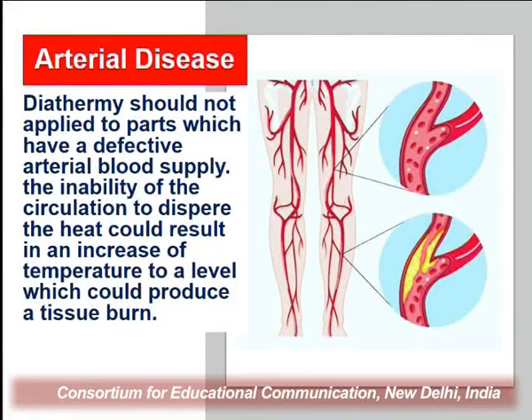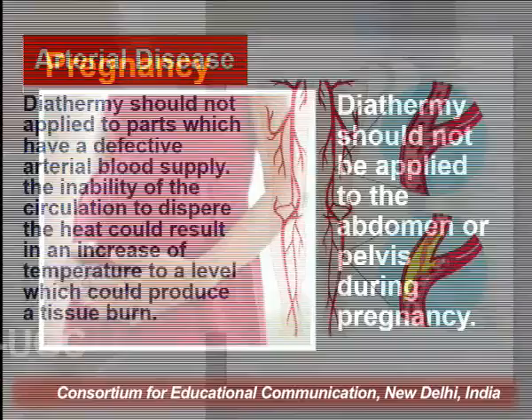Then arterial diseases. Diathermy should not be applied to parts which have a defective arterial blood supply. The inability of the circulation to disperse the heat could result in an increase of temperature to a level which could produce a tissue burn.